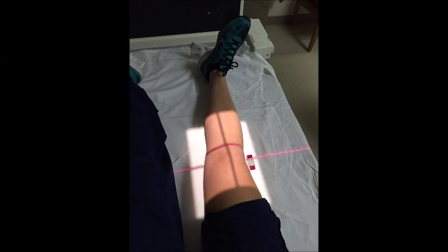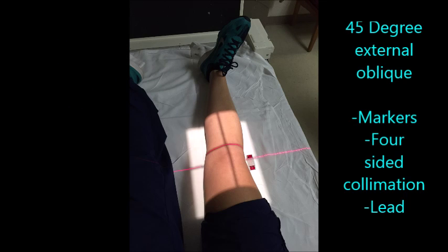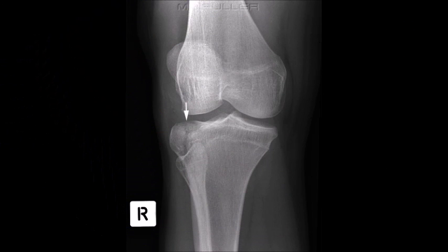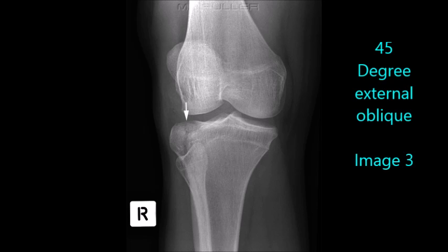For the external oblique, rotate the entire leg externally 45 degrees. Direct your central ray to the midpoint of the knee at a level half an inch distal to the apex of the patella. With collimation, be sure to include part of the femur and tib-fib.